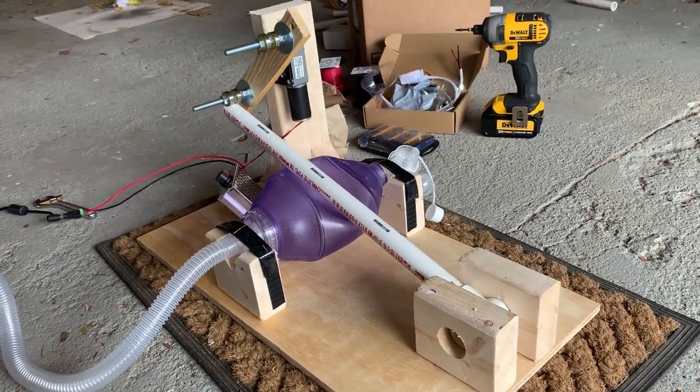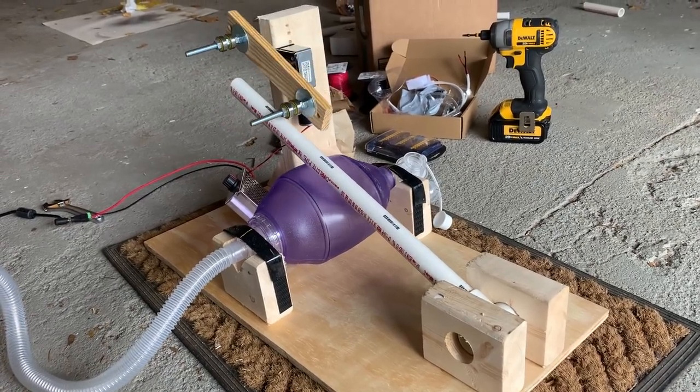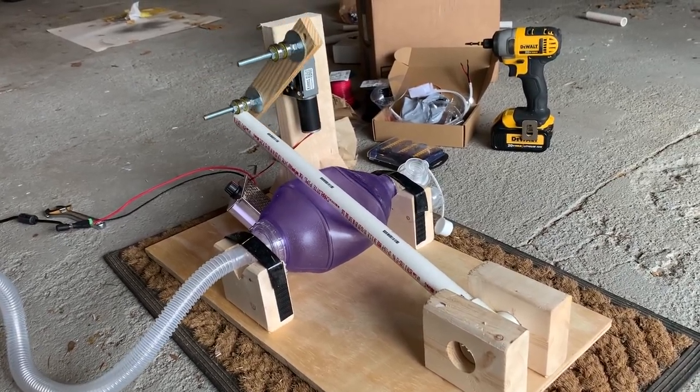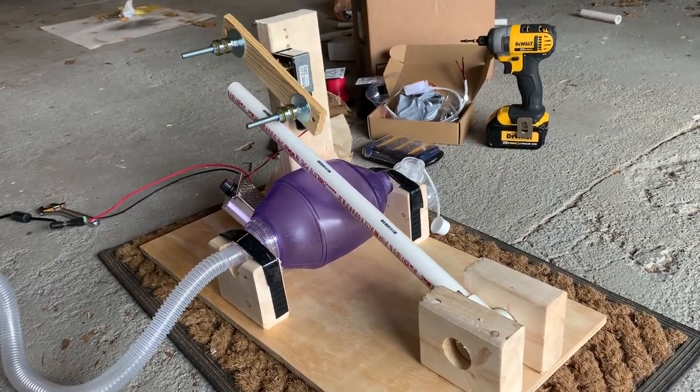The idea is that this is a disaster scenario, quote-unquote, ventilator, and/or for low-resourced areas. I hope we never end up in a situation where we have to use this, but I felt sort of compelled in the last couple days to try to throw this together.